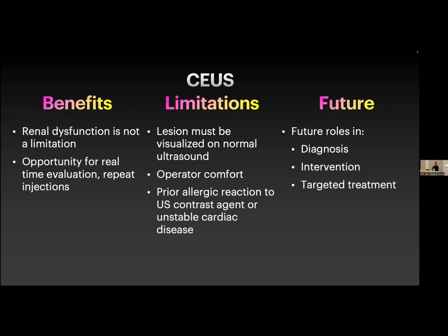So in those patients that have poor renal function and they can't have contrast for CT or MRI, this is a really great opportunity. If we can see the mass by ultrasound, we might be able to make the answer. And same thing as I mentioned before with ultrasound, if we don't get enough information on those first set of images, we can pop the bubbles and go back and re-inject. The injection is so small.